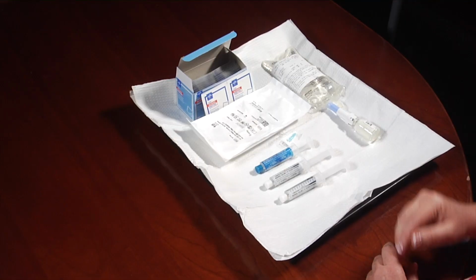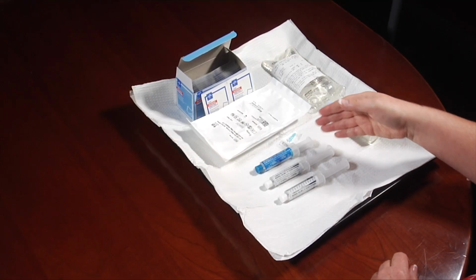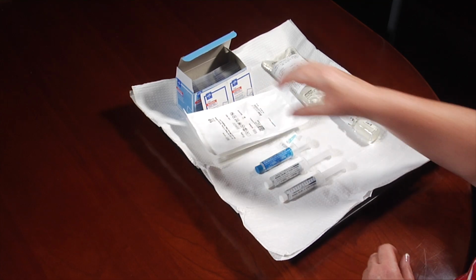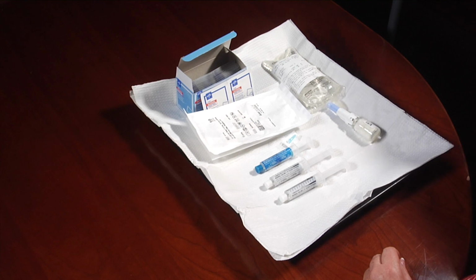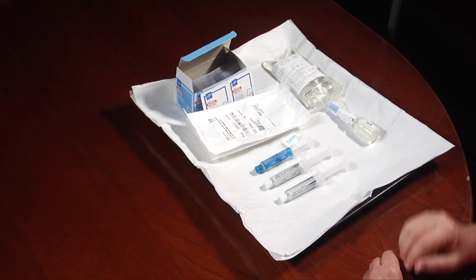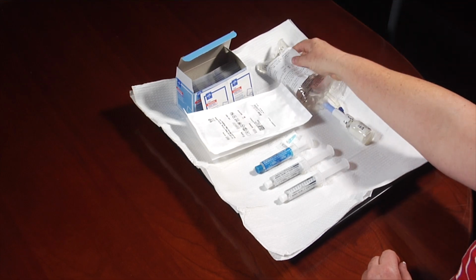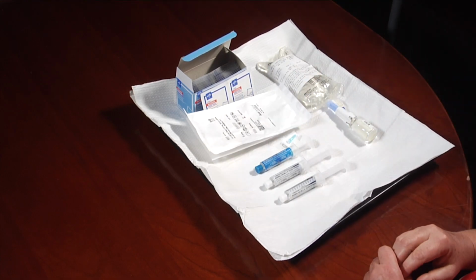Gather your flushing supplies, the gravity tubing with inline filter, the IV pole, medication bag with vial attached, and any other supplies as directed.